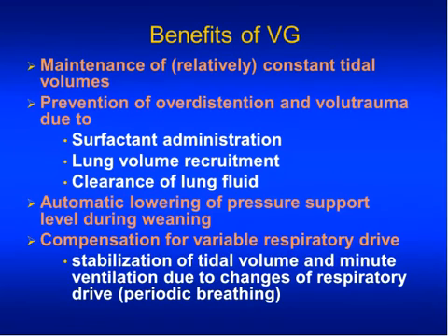And we'll move on to what we know about the volume guarantee approach, because that's been studied much more thoroughly than any other modes of respiratory support. There's a handful of papers with other modalities, but not nearly as many, and none of them have really looked at an important major outcome. So we do have data, and I will share a little bit of it with you.